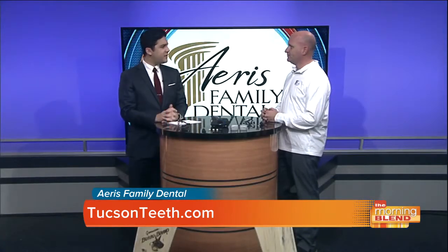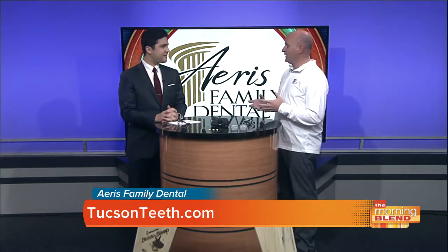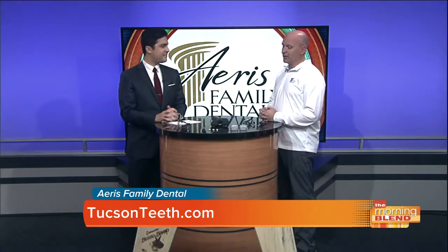And so what's the benefit of using these types of materials? Well, zirconia is, again, one piece. It's milled out of a block or a puck, and it can be very, very strong. We know the material, we know what it is, we know how it's going to perform, and we're even getting it better and better looking nowadays. It's the same material as, say, fake diamonds, cubic zirconia. Okay. And so we're even getting it to look better and better every year.